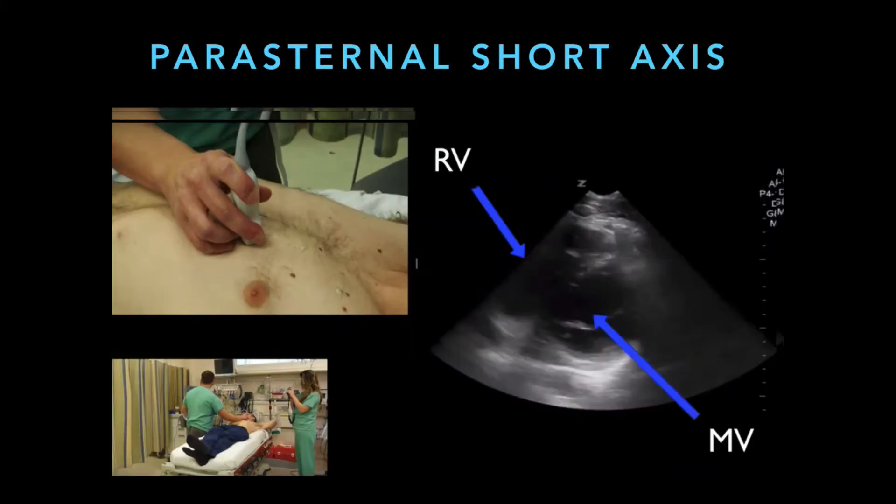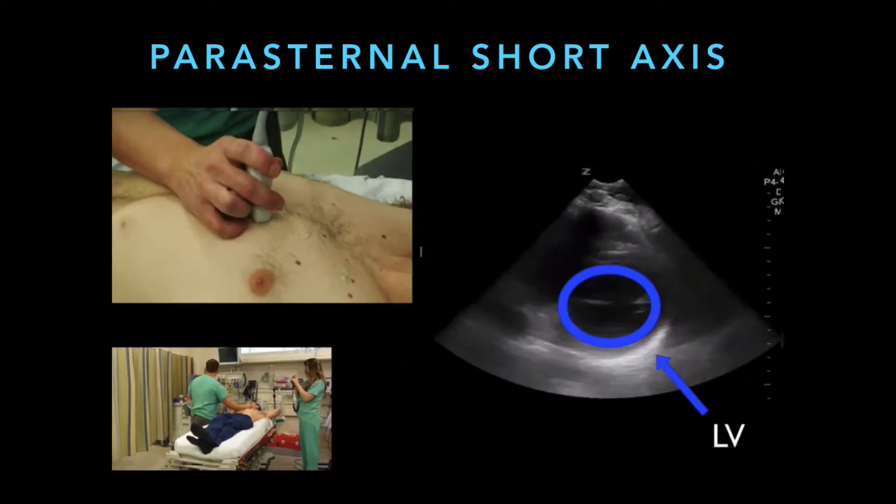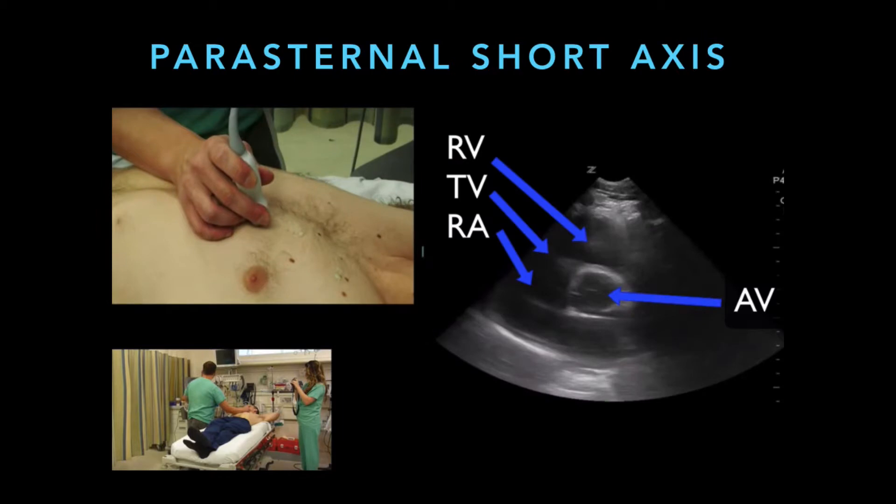Depending on how you angle your probe, you can see different things. Usually right in the middle is where we see the mitral valve, and then if we angle the probe up towards the root of the heart or up towards the patient's head a little bit higher, you can see the aortic valve right in the middle.